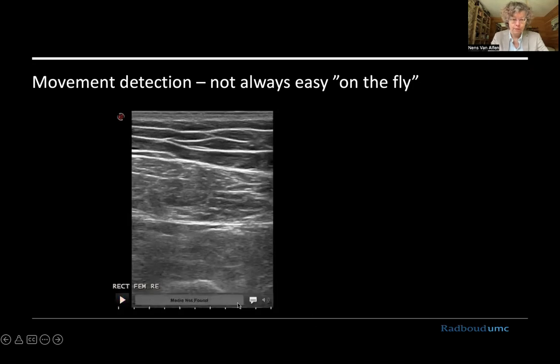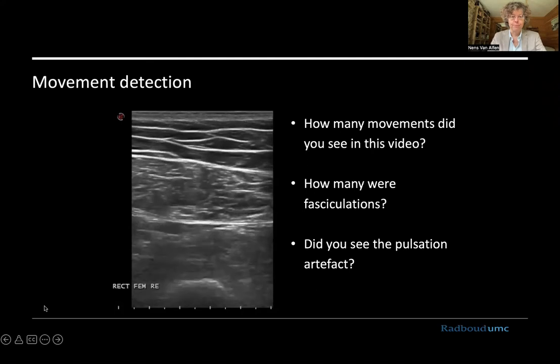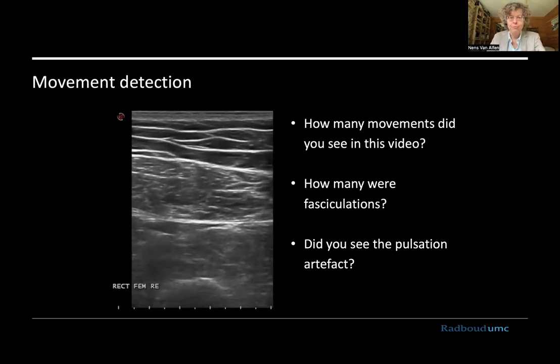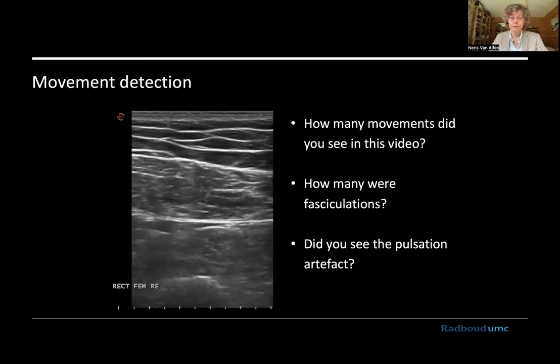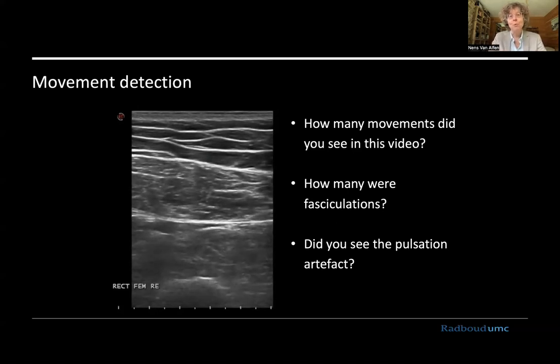But it's not always easy on the fly, as this video will show you. Just try to figure out for yourself: how many movements do you really see in this video, and how many of those were fasciculations? Are you seeing the pulsation artifact here? This is a 30-second segment, and you can imagine that if you have a one- or two-minute fragment, it becomes a real strain on the brain to remember everything going on. There's no prize for the actual number of movements, but this shows the concept that it's difficult for us to manage this at just one glance.